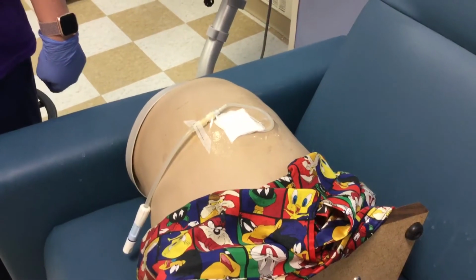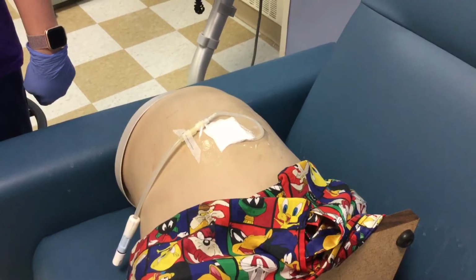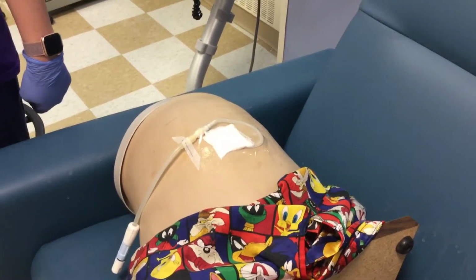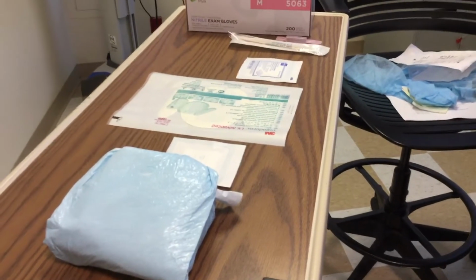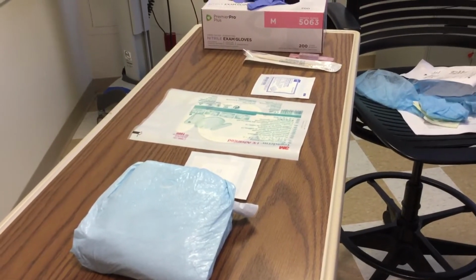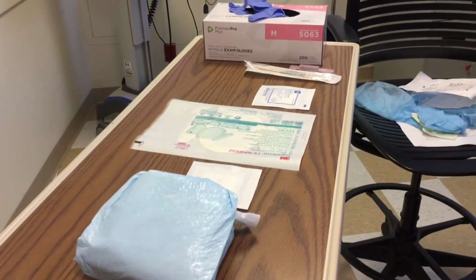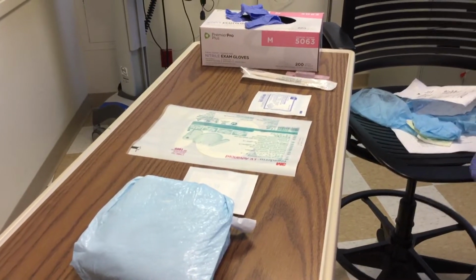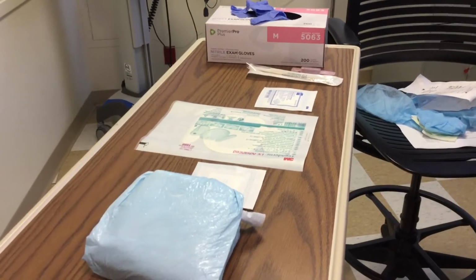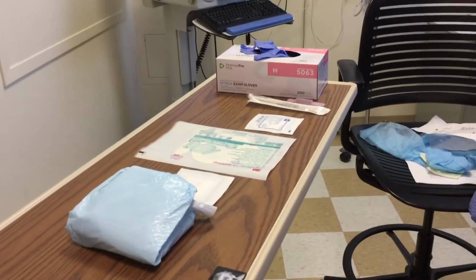All right, we are going to talk through how to change a peritoneal dialysis catheter dressing. First, you're going to gather your supplies. So you will need a sterile dressing change kit, clean gloves, cotton tip applicators, sterile pink saline squirts, 2x2 gauze, Tegaderm, and a helper. So first you're going to gather those supplies.